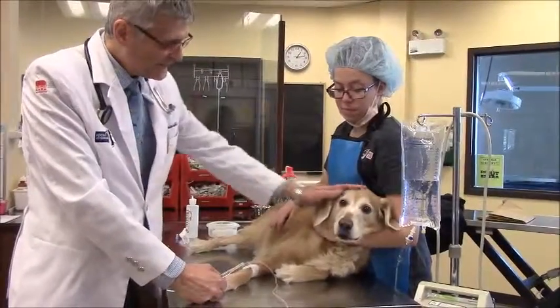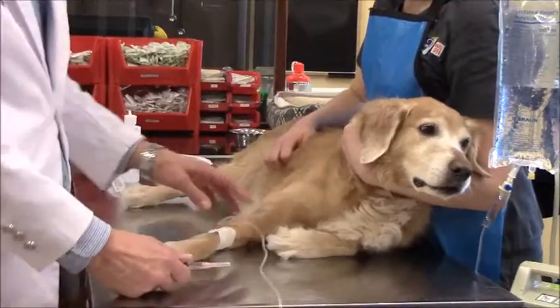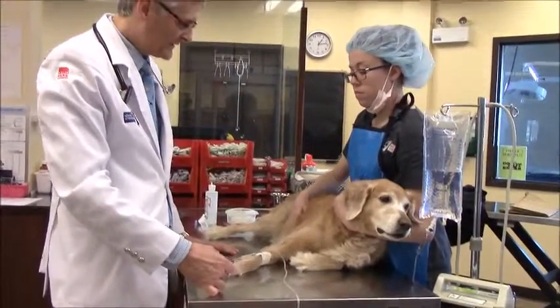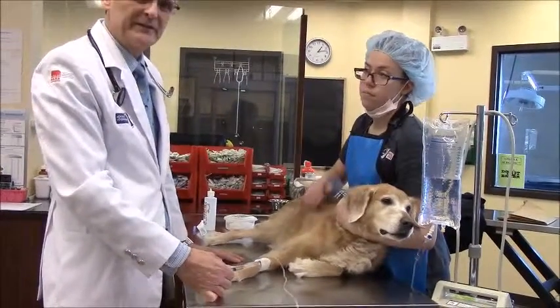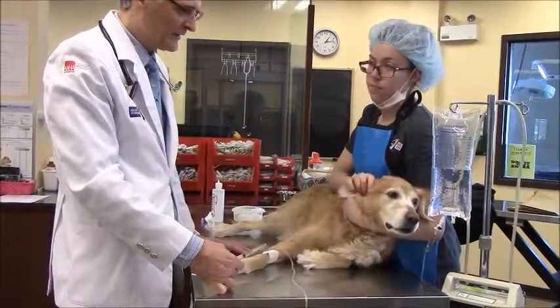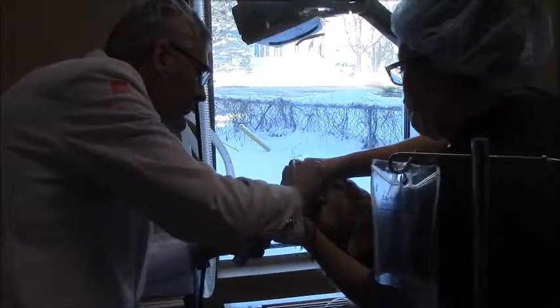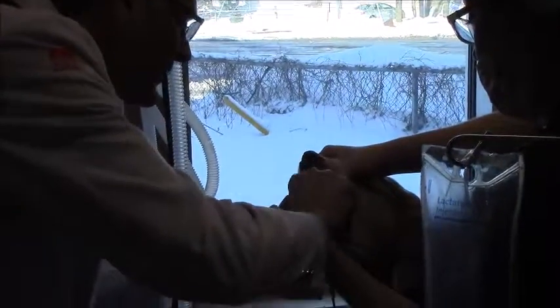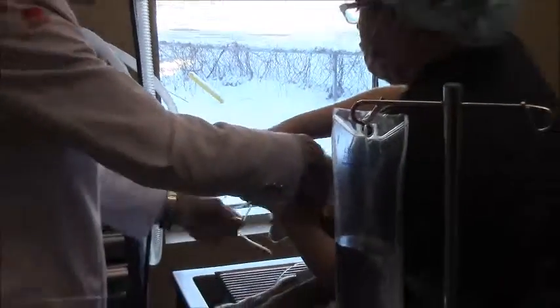Here we are back. Ruby is, as you can see, sedated. It's been 30 minutes. We put the IV on, and now I'm going to induce anesthesia. We're going to put her on the IV pump and take her to the dental x-ray room where we'll start the procedure. The fluids intravenously are given to maintain optimal blood pressure, which can fall because of anesthesia — the fluids supplement the volume in the blood vessels so that blood pressure doesn't drop. We're now going to place an endotracheal tube, which goes down into her airway so we can maintain oxygen delivery to the lungs and control her respiration.